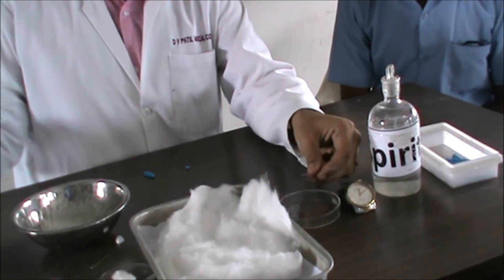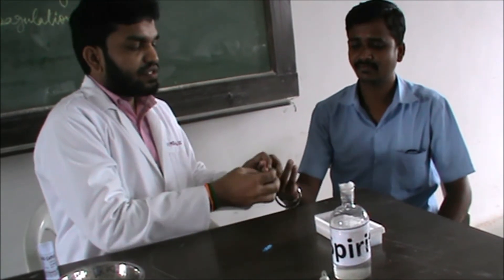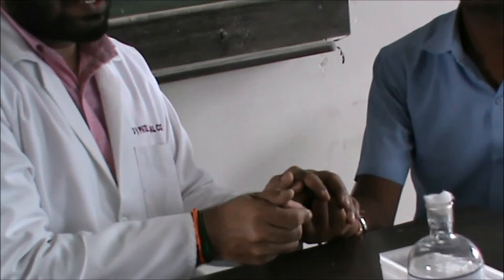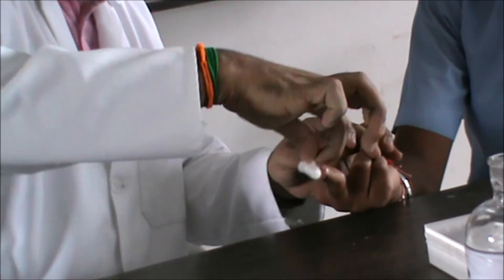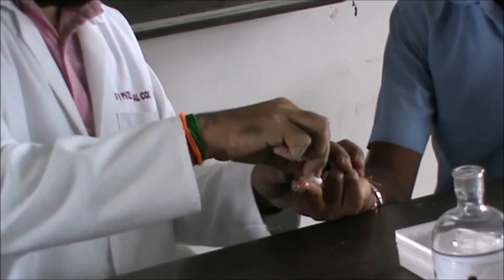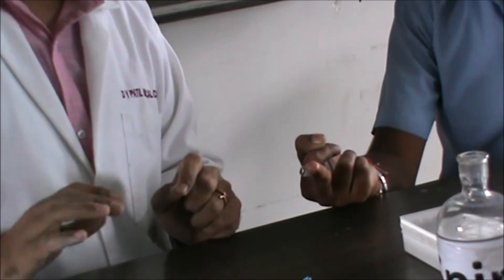Now we will start the blood collection procedure. First, keep the spirit ready and choose the finger — I am going to choose the middle finger. Give a gentle massage to the finger for blood collection. Then take a spirit-soaked cotton swab and start wiping the fingertip. This step is very important because most students make errors here. Wipe the tip once, then don't touch the finger again. Keep the cotton swab in the watch glass and don't contaminate your area. Let it dry.